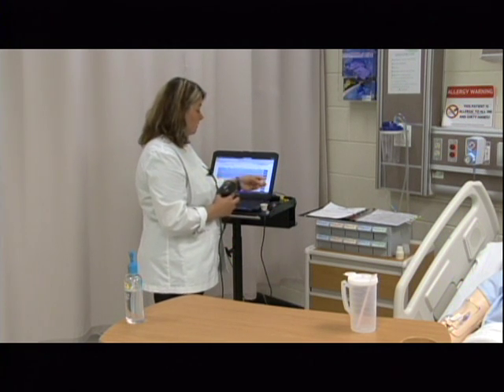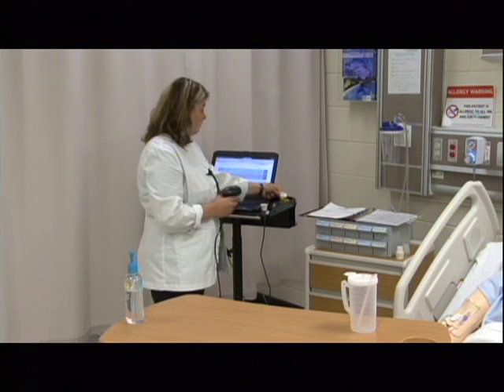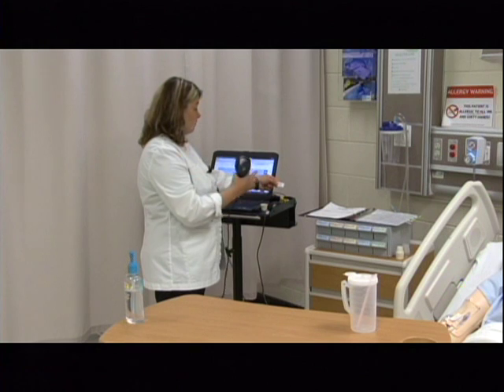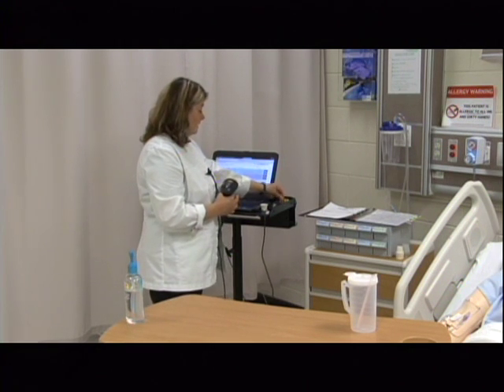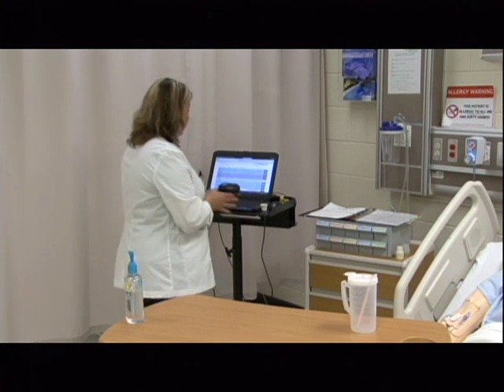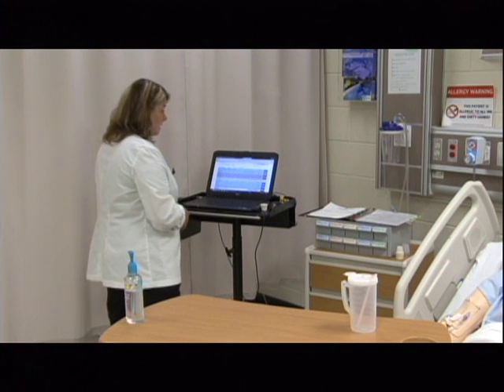So what I need to do is make sure and go through and scan each medication individually. And once I scan that one, again, confirming the right medication, the right dose, the right time, the right route, expiration date. Then I'm going to come over and scan the second dose of the Prinivil. I have now scanned each medication individually and confirmed for my second check.